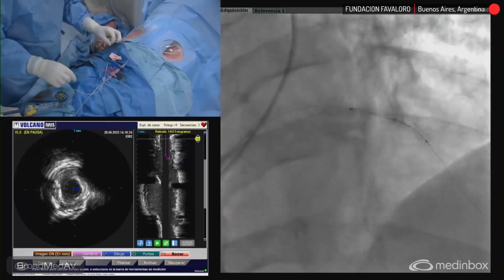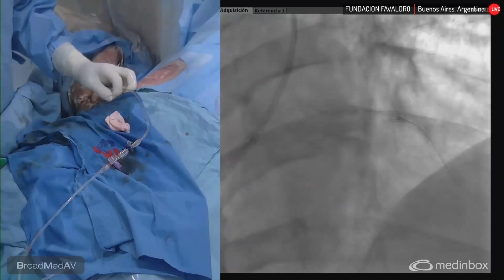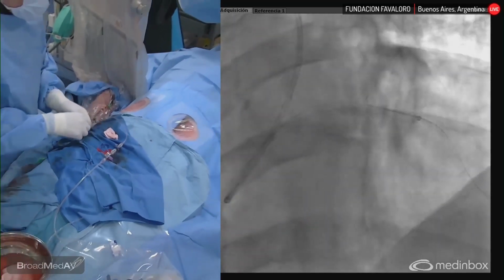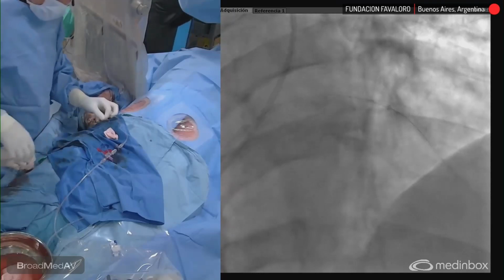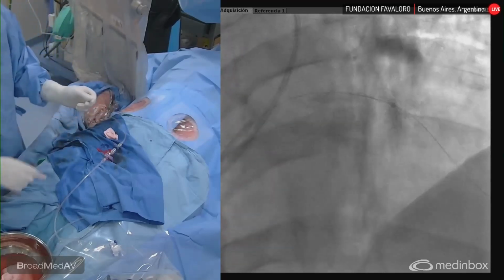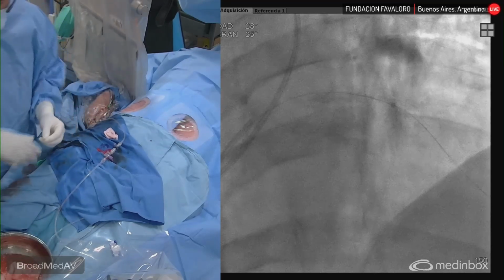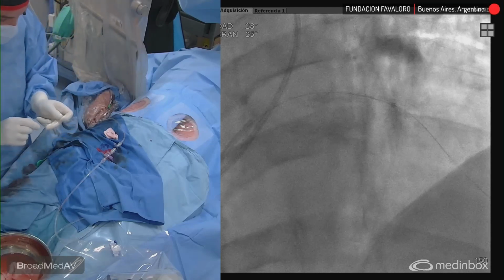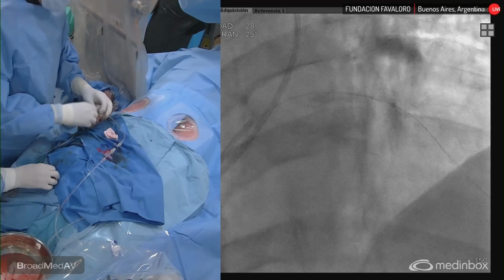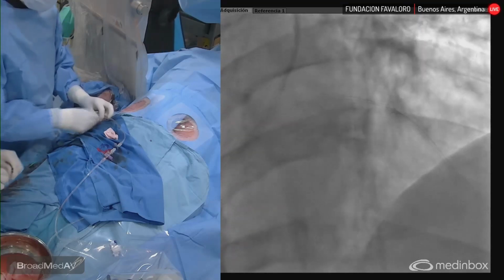Okay, which stent would you use, Gustavo? 3.5 or 4? 3.5. Okay, give me a 3.5 by 24. So I use the balloon from the stent as a support, a protection to advance the guide extension so that I have a perfect position there. So it's going to be easier to advance the 3.5 stent into this curve. That would have been difficult with this guide support, which is actually very weak. I think that the 3.5 will give you better navigation inside the vessel, and then you can go up to 3.9 through 3.8. Absolutely.